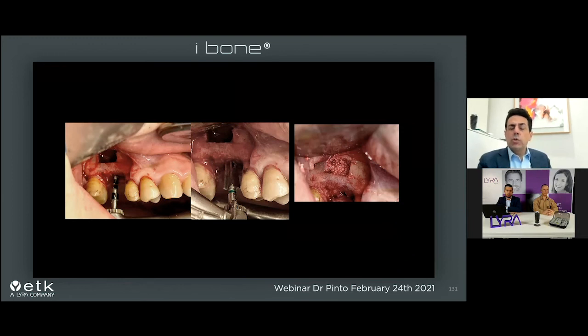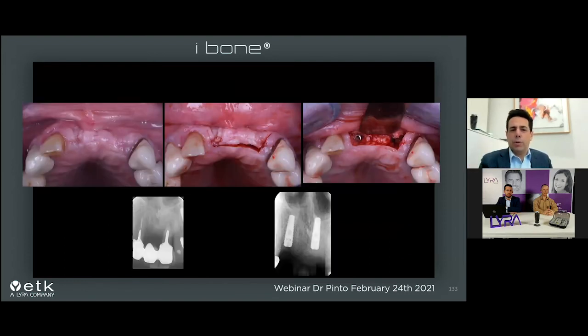And to show you that we use exactly the same reamer that I told you before, it means that even with the 2 millimeters that we have, it's very, very short. But you can use the reamer to continue to augment the density of the bone. And you put it on the reverse, and like that, you can augment the stability of the bone. Okay? But we can see in some other cases we don't need to have a very large spire because of the shape of the core, the conical core, and with the design of the spire, even if they are very short, they are extremely sharp.